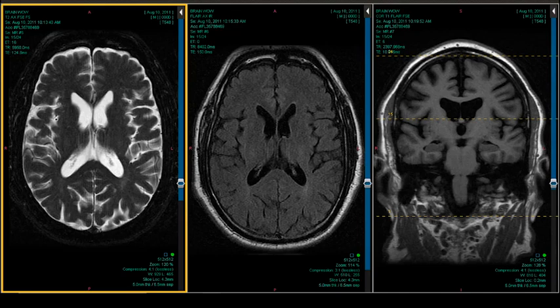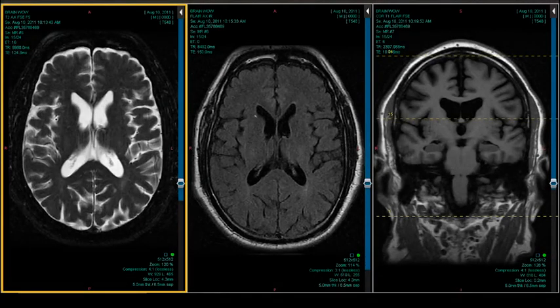the more quickly you bring them up and then invert them, the more sensitive your diffusion image. And that's known as the B value. Typically in neuro, you want B values of over 800 to 1,000. In the prostate, you want it over 1,200 to 1,400, ideally 1,400 to 1,600. So a B0 is nothing more than a fast echoplanar T2 image without any diffusion gradients turned on. And a B1000 means the gradients are turned on and quickly ramped up and then inverted so that you can detect micromolecular losses of motion or stiffness in tissue from diffusion restriction.